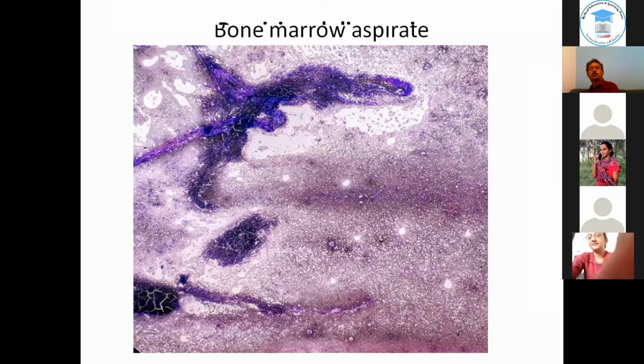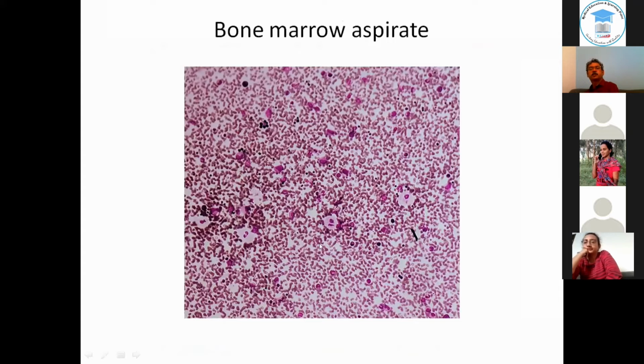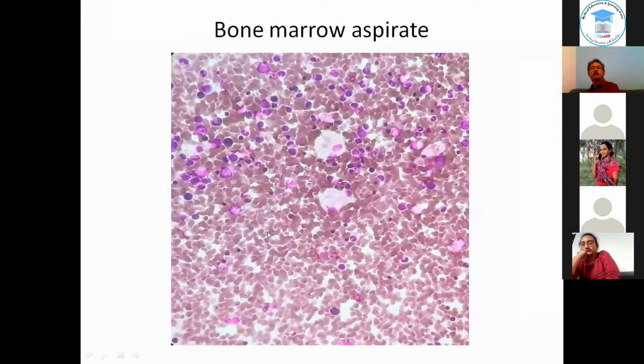And this is a normal aspirate, and here we can see something. Okay. Again, you can see these cells which have clear cytoplasm. Clear cytoplasm again in these cells. Clear cytoplasm, large macrophages, what is called, well, wrinkled paper.